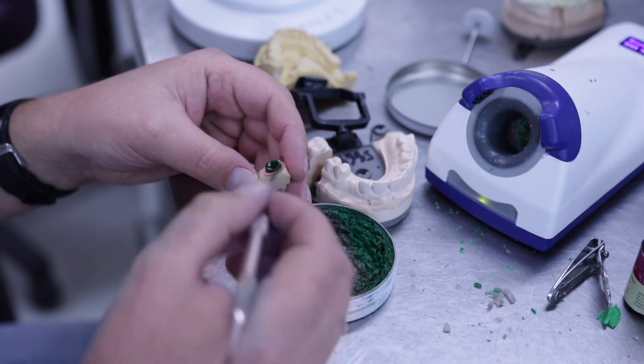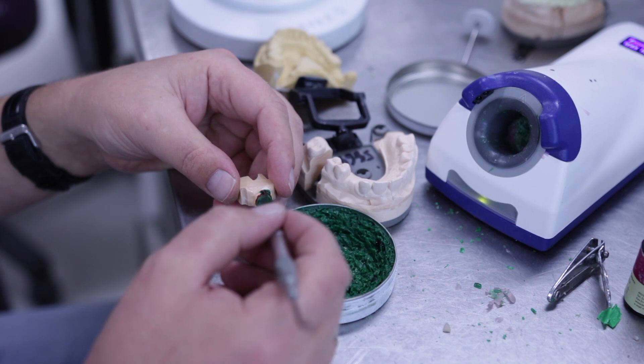Make sure to isolate your dies, then you can start your wax modelling.